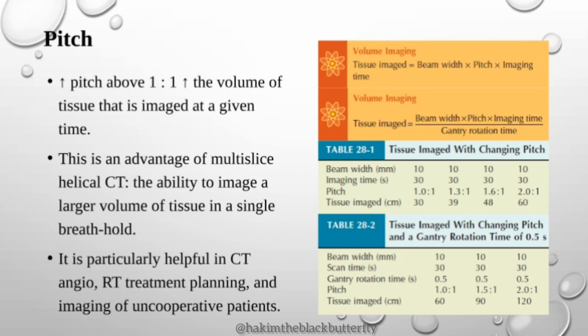It is not giving you a completely inaccurate thing. It can do the interpolation, but again, the information won't be as accurate as if the pitch was 1 or even less than 1. So it limits you on how far you can go when it comes to the pitch. So it can only give you a pitch where interpolation can be done.